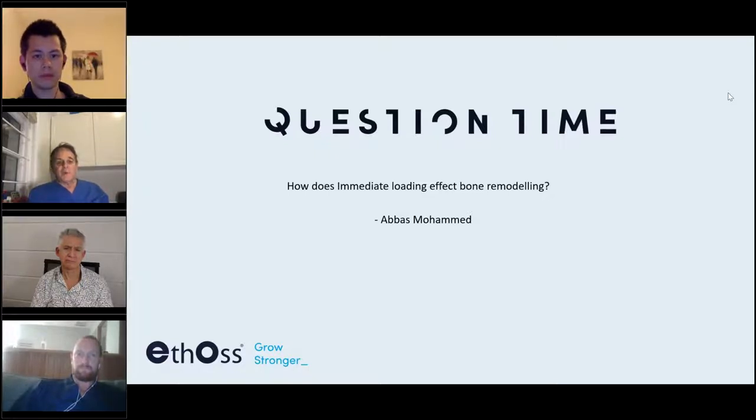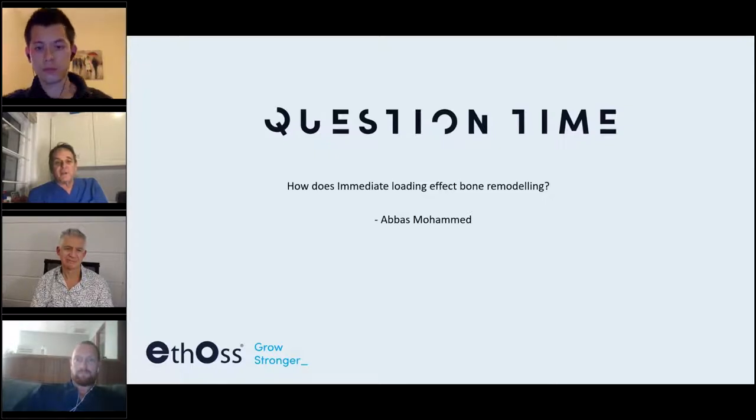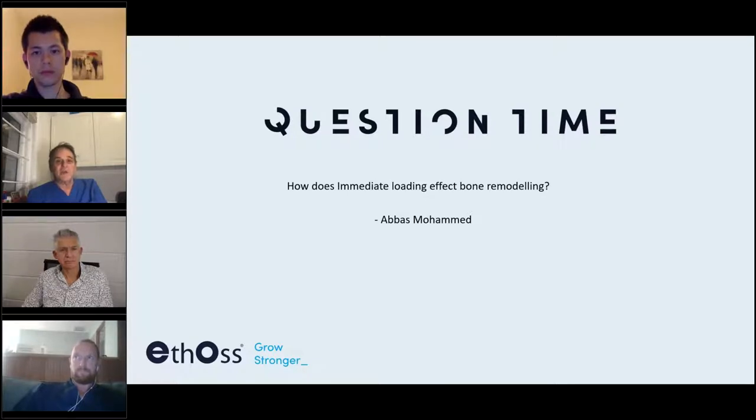Right, thanks. I think that's probably answered. I don't know, Abbas, if you've actually been to Dubai to same day, if you want to, an interesting experience where Costa's loading everything with the temporary that afternoon after he's placed the surgery, and the next week they all get their final restorations. And this is in every case, singles, bridges, cross arch, it's zygomatics. It's quite an experience, and it really is an idea for the future, I think.